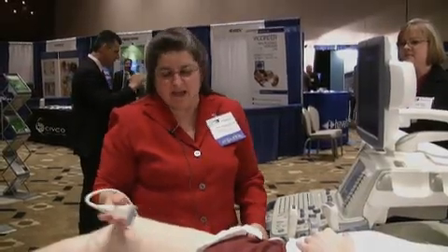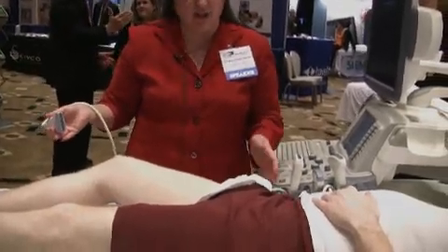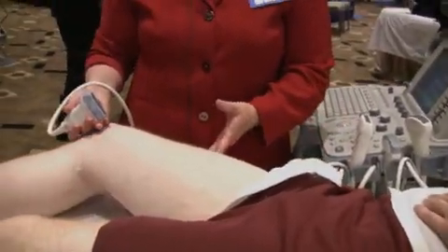Hello, my name's Anne-Marie Kupinski, and I'm going to take you through doing a lower extremity arterial duplex ultrasound exam. As you can see from the patient, this is how we would like to have folks position, having their hip slightly externally rotated and their knee slightly flexed.